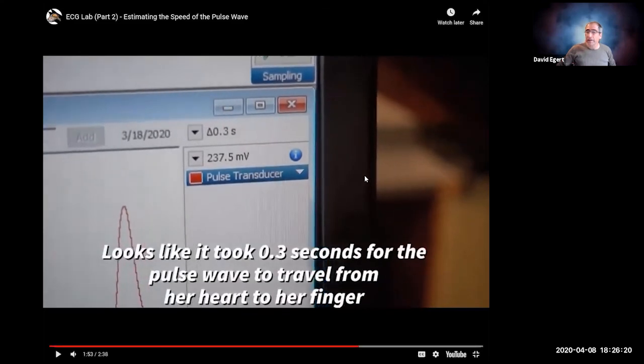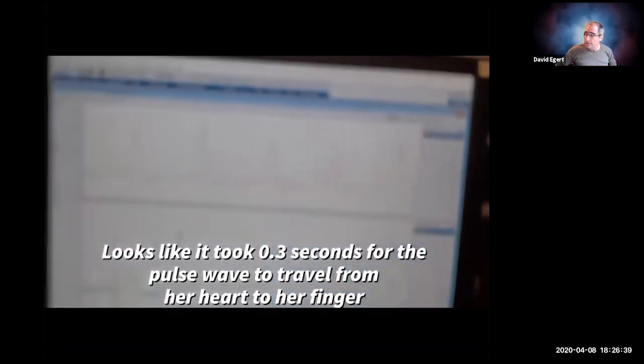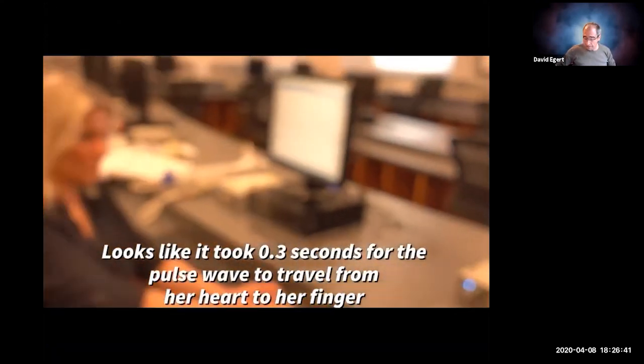So you're going to need to take note of this, because part of your write-up, when you're calculating that rate, like we said, rate is going to be distance divided by time. So this time is going to be important for you to calculate your rate. Now we have to see the distance that the pulse wave went.